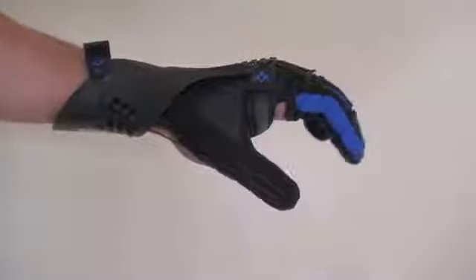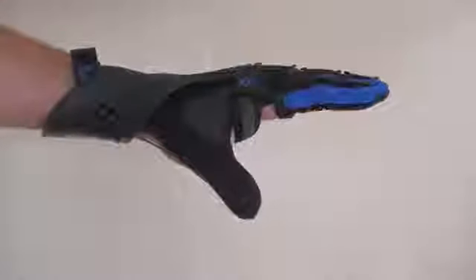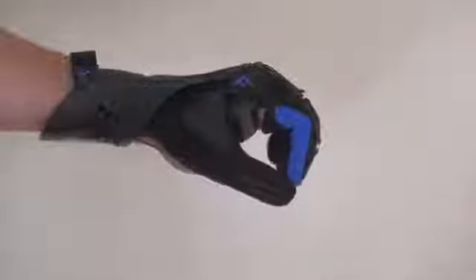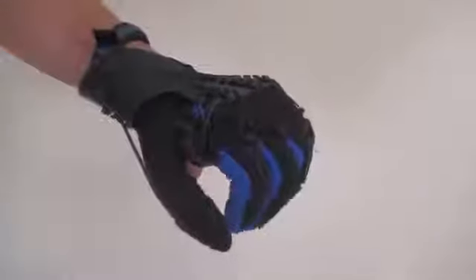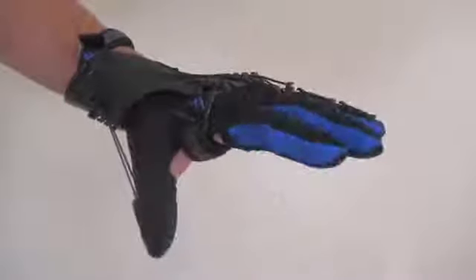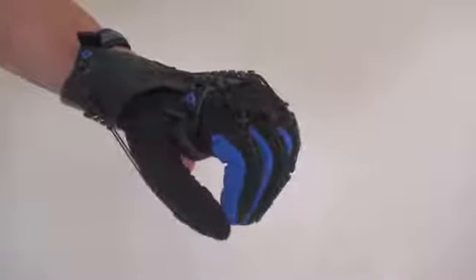Here's how the SABO Glove works. As a client flexes or squeezes his or her hand to attempt to grasp an object, the individual tensioners become taut. As a client begins to relax his or her flexors or stop gripping, the pre-loaded tensioners naturally want to recoil. This results in pulling back or re-extending the fingers to an open position.